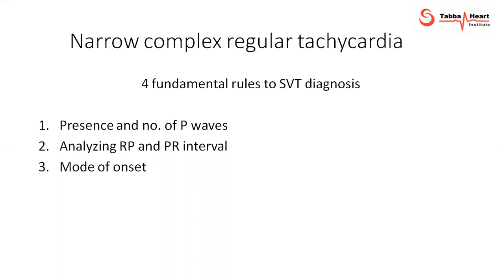But if you have an opportunity to see the onset of a tachycardia, especially when somebody is on telemetry monitoring or Holter monitoring, you can see how the tachycardia starts and the mode of termination, right? So you may see a mode of termination spontaneously, or you may use some maneuvers or drugs to terminate the tachycardia. That will also help you, right?